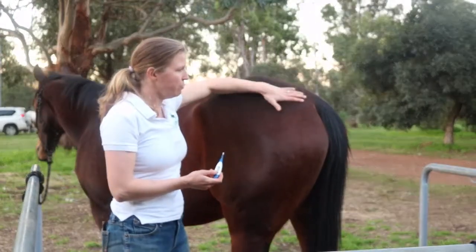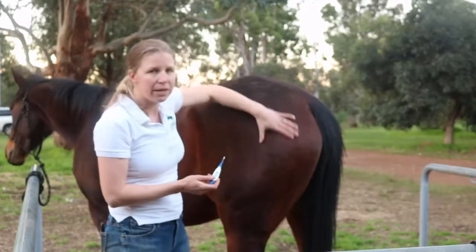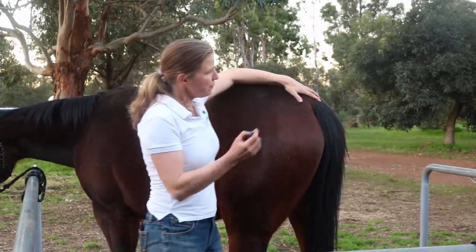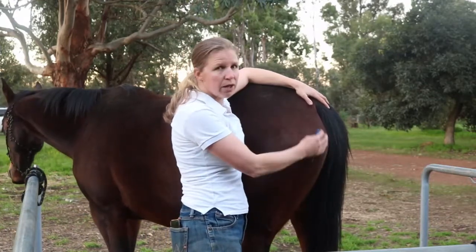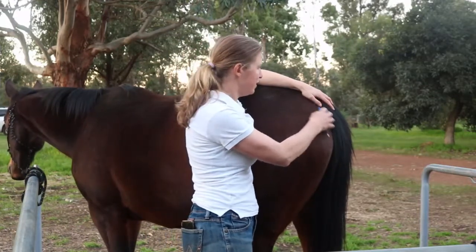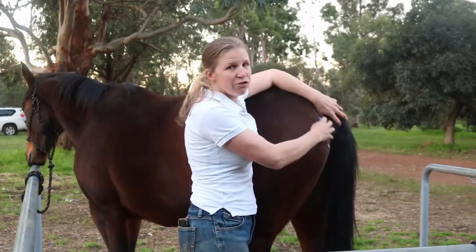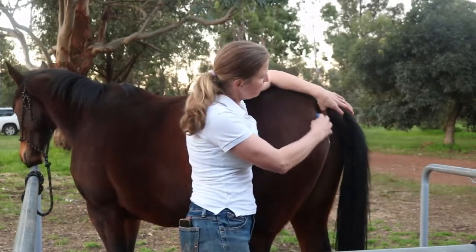I know this horse really well so I feel safe being back here. I've got my digital thermometer. I stand right next to the horse — not right behind obviously, because that's not a safe place to be. I generally just give them a really good scratch around the tail and that gets them really relaxed and lifts their tail up.